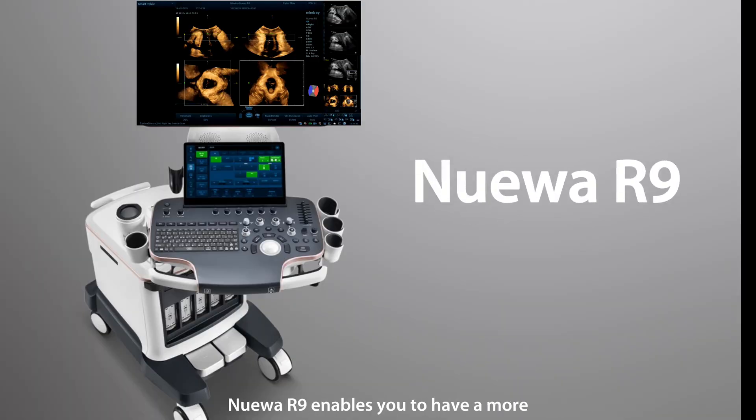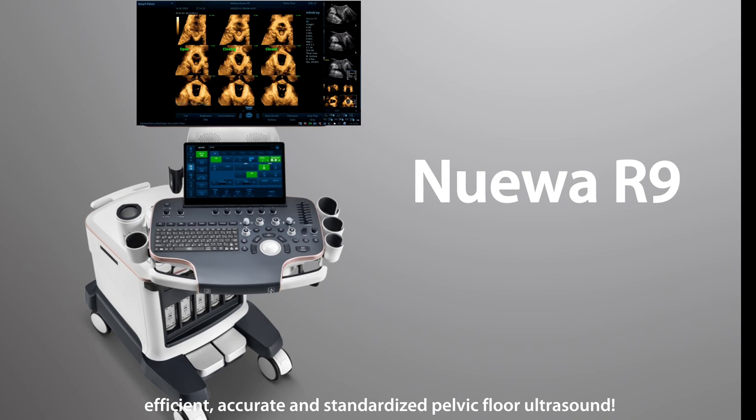Nuewa R9 enables you to have a more efficient, accurate, and standardized pelvic floor ultrasound.